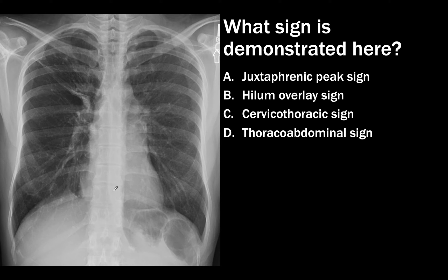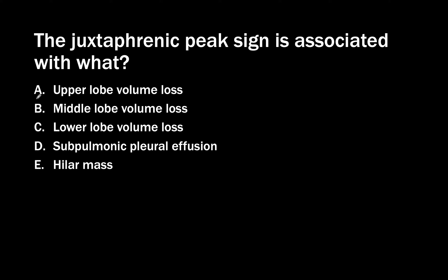Case 37. What sign is demonstrated here? The patient's minor fissure is pulled upward because of volume loss in their right upper lobe, and there is tenting of the right hemidiaphragm. This is called the juxtaphrenic peak sign. It is associated with upper lobe volume loss — not lower lobe volume loss. The juxtaphrenic peak occurs along the diaphragm but is specifically a sign of upper lobe volume loss.